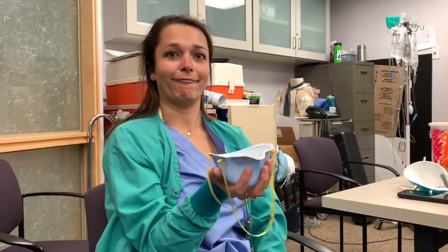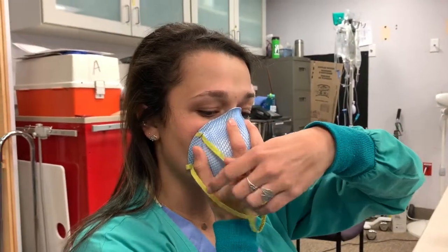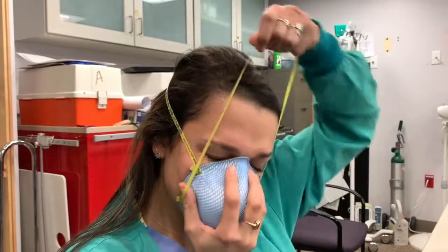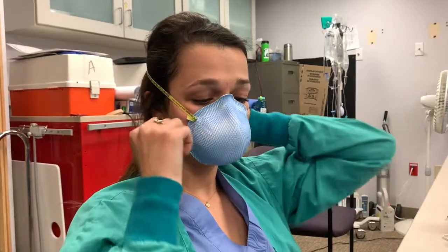This is a different kind of mask, but the same procedure applies for your seal check. Put the mask on — top strap over your head up high, bottom strap down low on your neck. Make sure your straps don't cross. Always check the integrity of your mask, especially if you're reusing it.